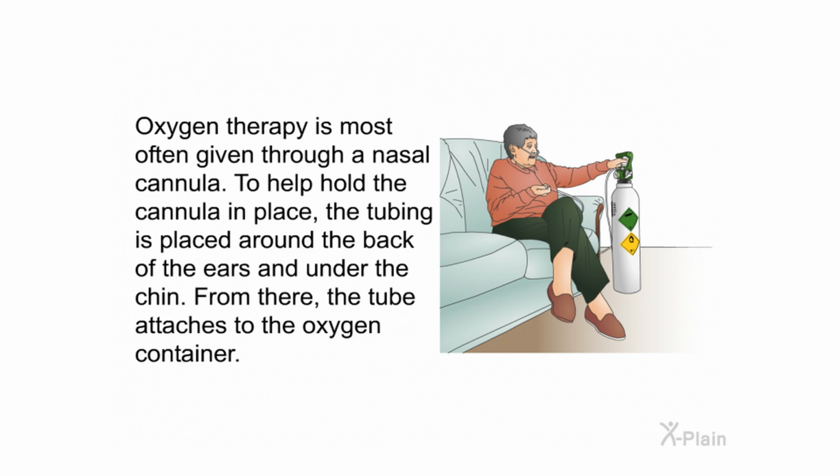Oxygen therapy is most often given through a nasal cannula. To help hold the cannula in place, the tubing is placed around the back of the ears and under the chin. From there, the tube attaches to the oxygen container.